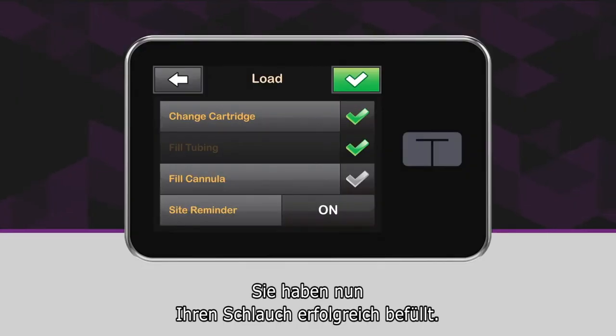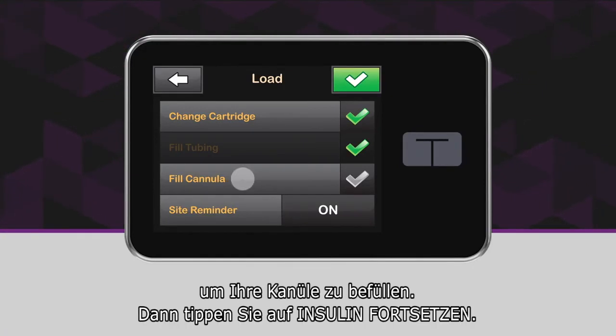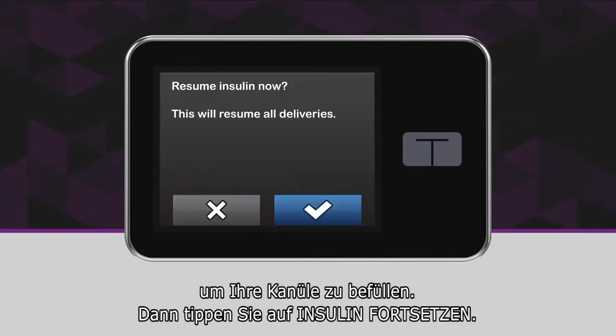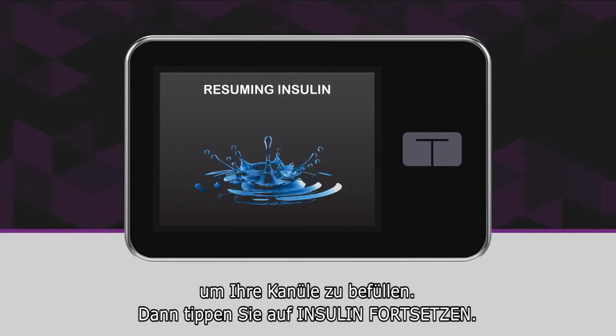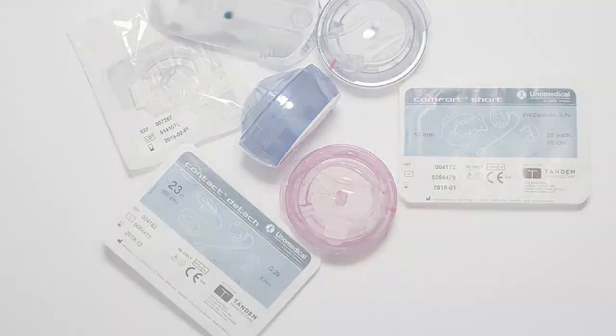You have now successfully filled your tubing. Refer to the instructions for your specific infusion set to insert and fill your cannula, then resume insulin delivery. Visit our website for videos about each of the infusion sets we offer.